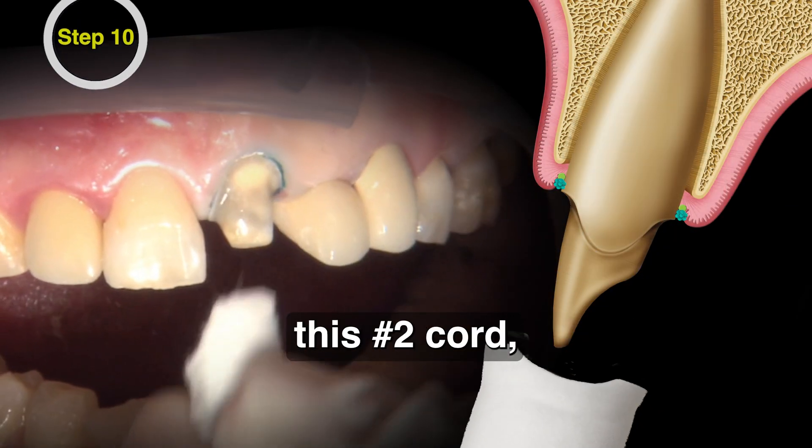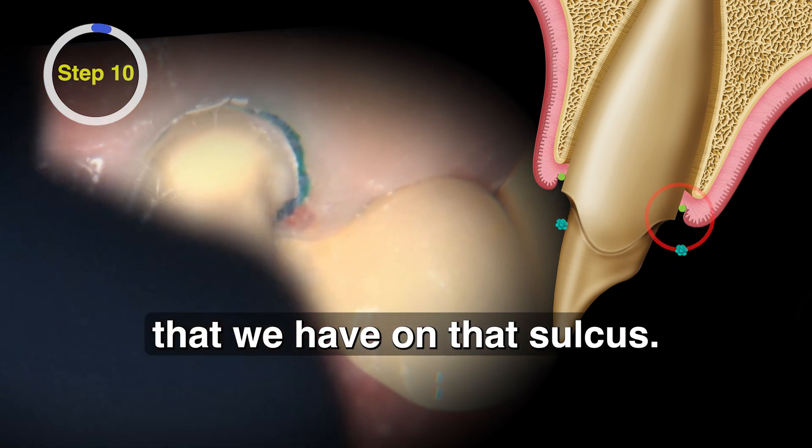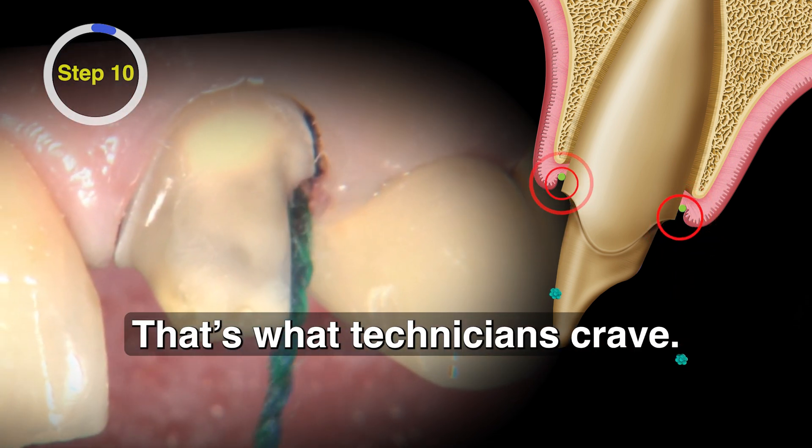We're pulling out this number two cord and you can just see the lateral retraction that we have on that sulcus. That's what technicians crave.